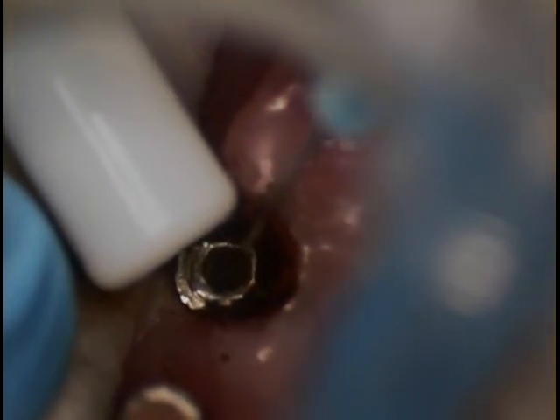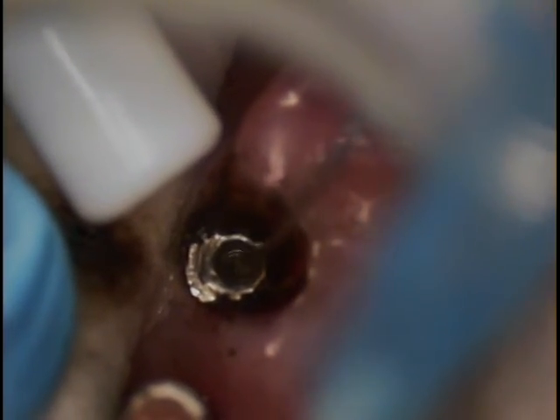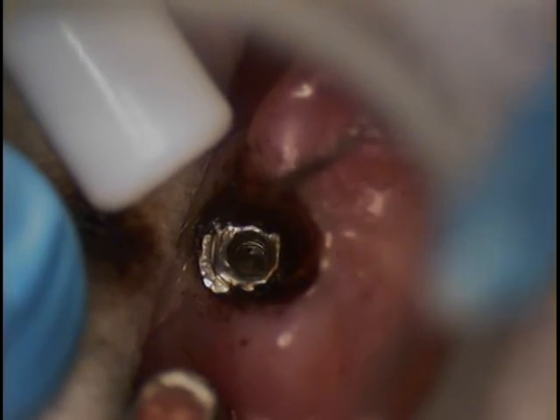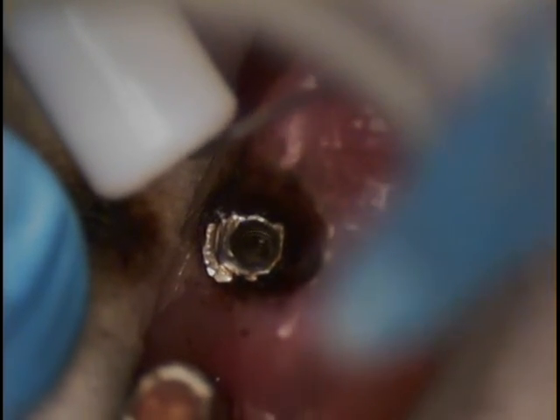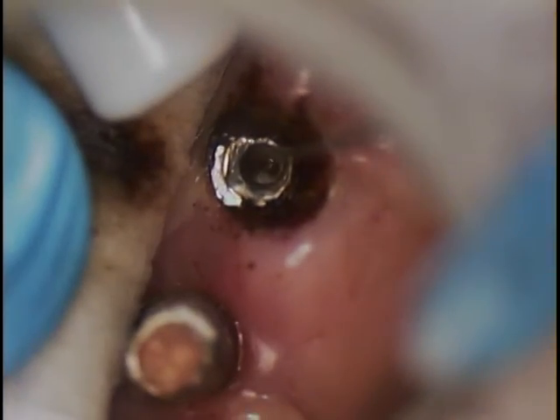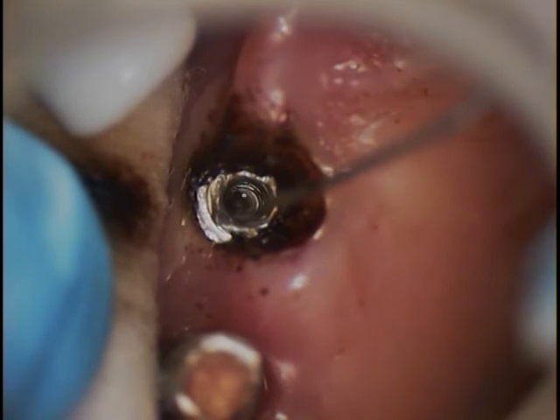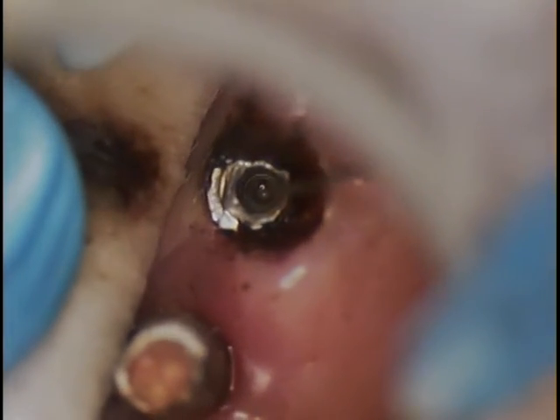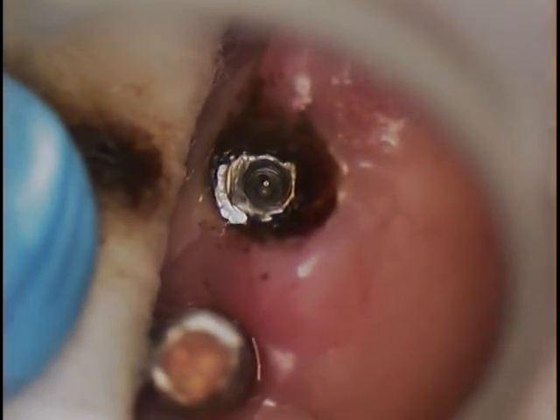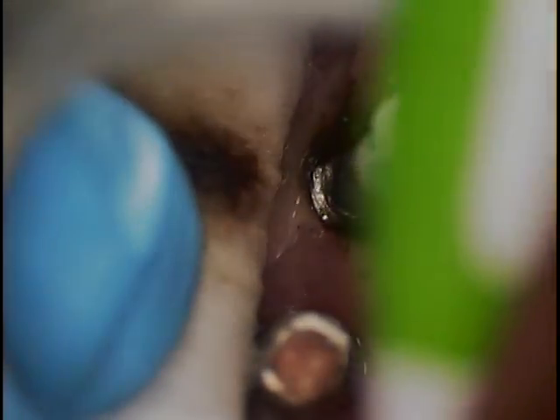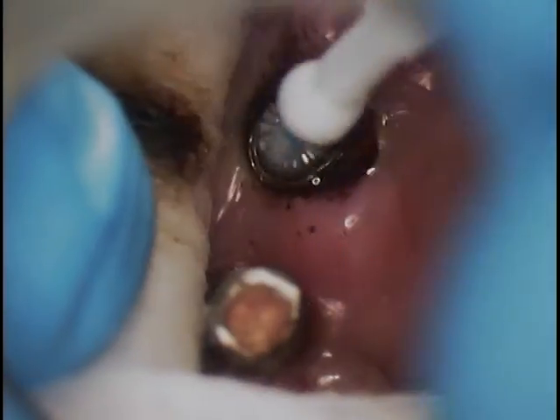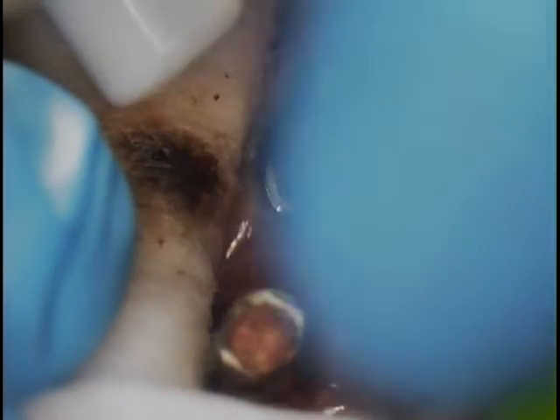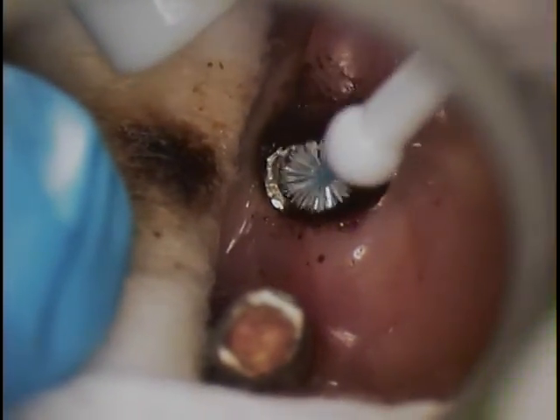We're going to soak that again. I'll let that soak, and I might just leave that in there as a lubricant. We do have a retapper that's a little bit beyond. Okay, suction that, continue to suction that.